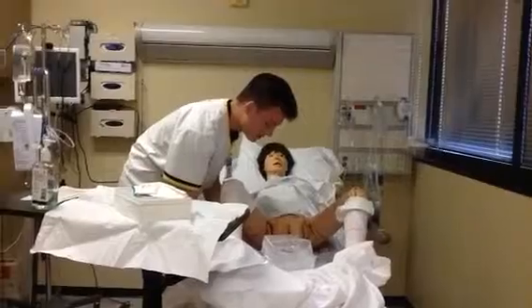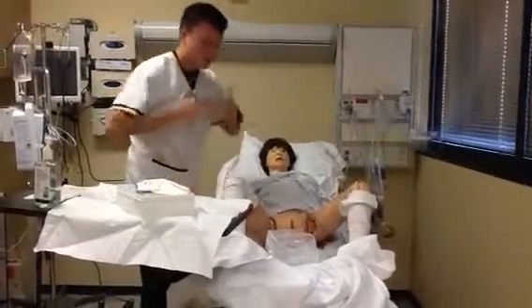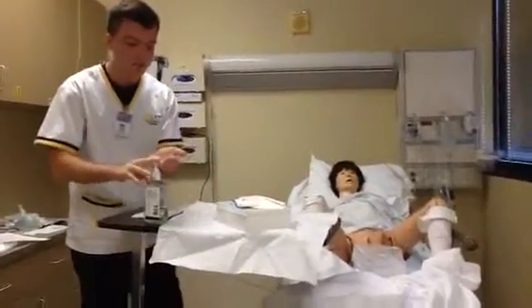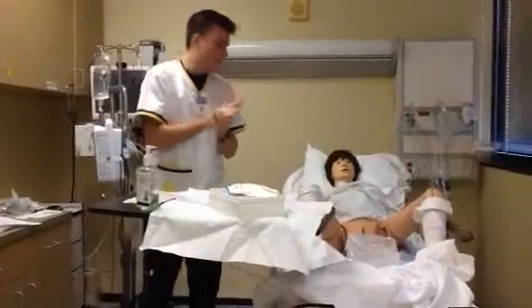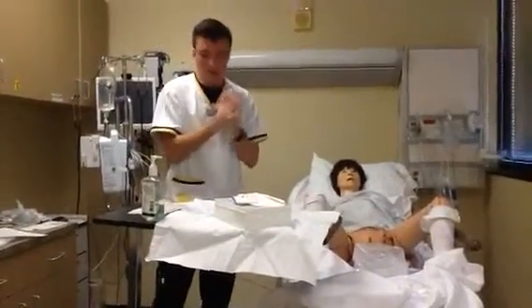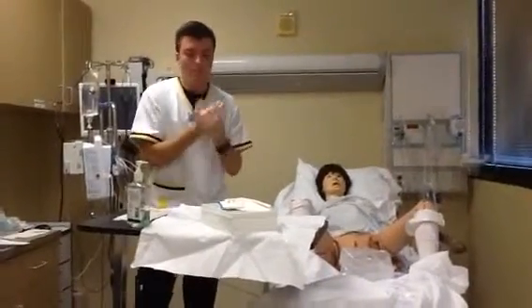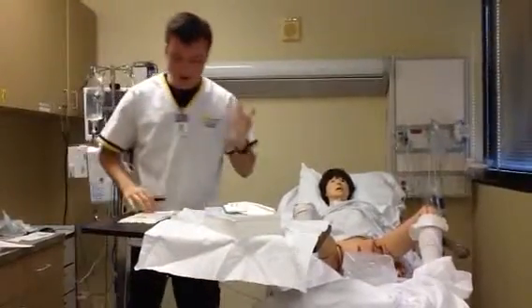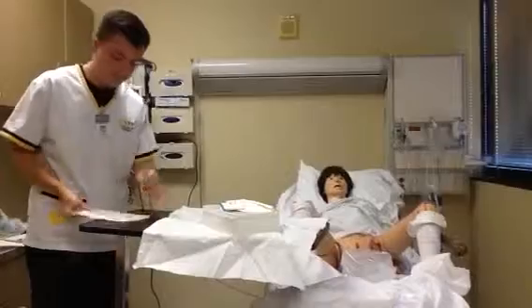Make some adjustments as necessary, as long as I stay in front of the sterile field, and if I touch within the 1-inch borders. And since I've been touching the patient, and haven't been using gloves, I'm going to do hand hygiene one more time. Going to remove the hand sanitizer from the table. And now I'm ready to don my sterile gloves.